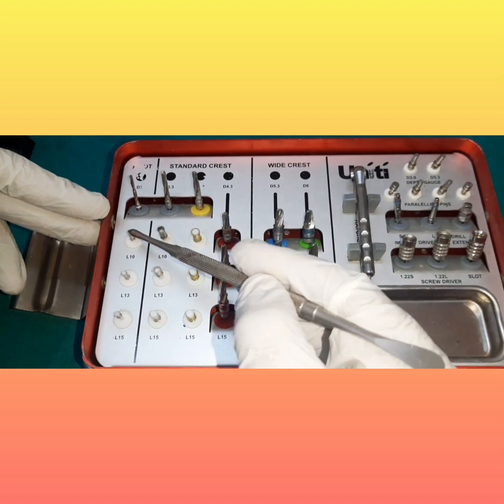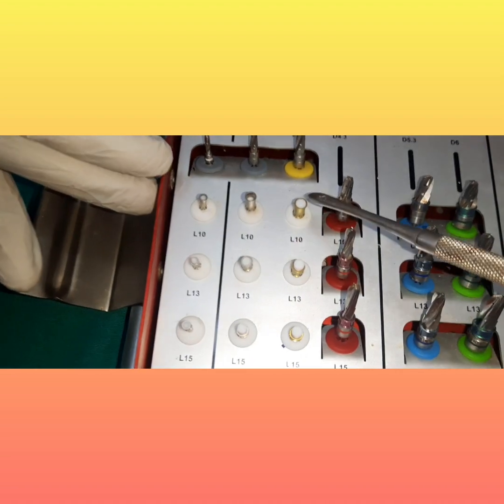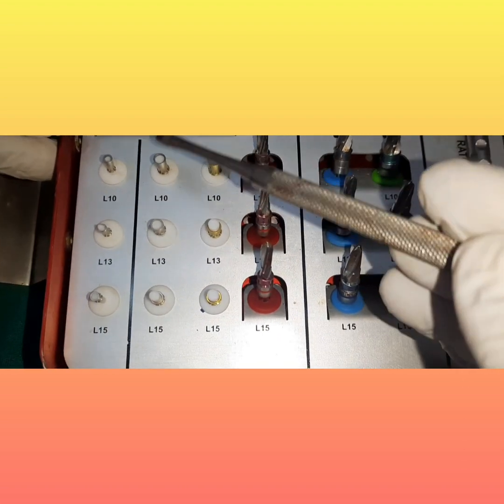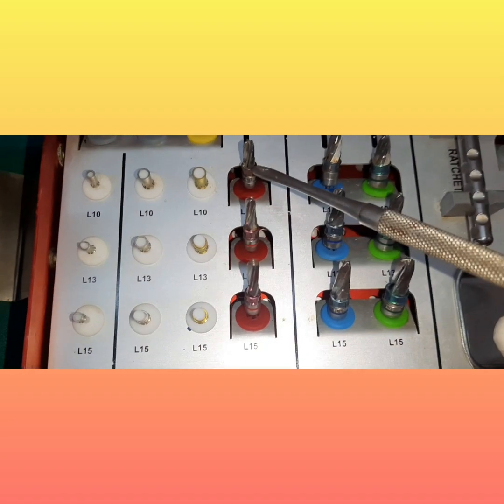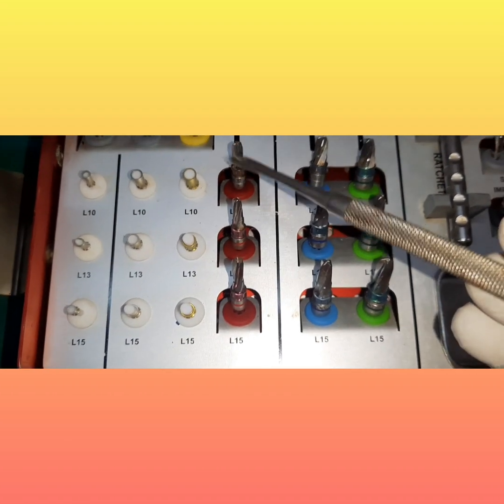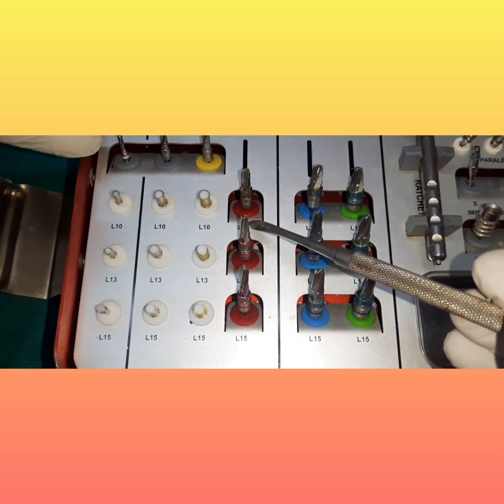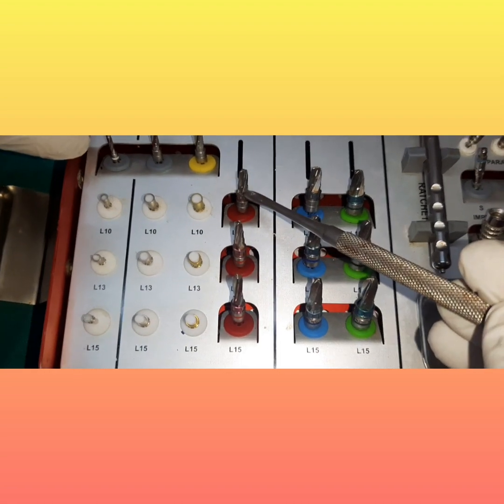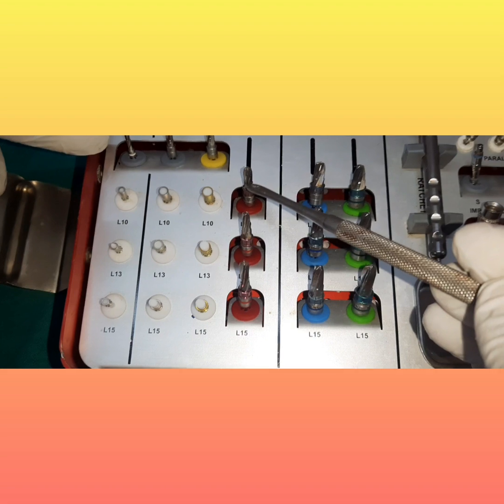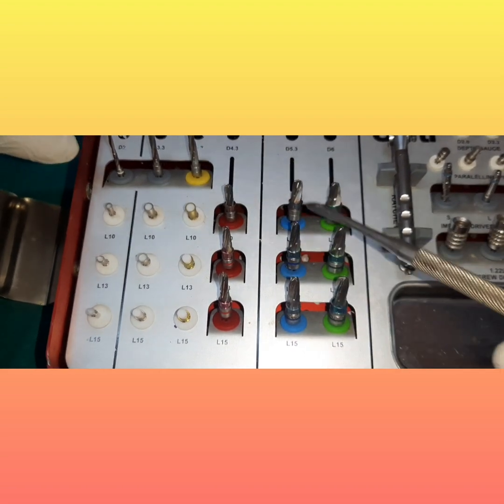Apart from this, you have these instruments which you see here, that is for maintaining the height. You can just place it onto these drills, as you can see here. This will not allow your drill to go further beyond, say you want to place an implant till the length of 10 millimeters. This helps as a stopper, it will not allow this drill to go further than 10 millimeters. So this way we are going to use this.